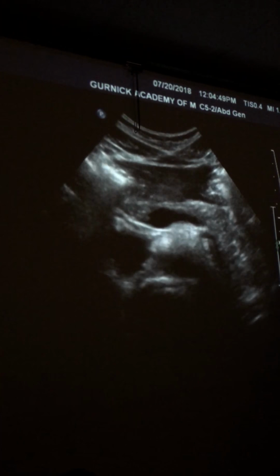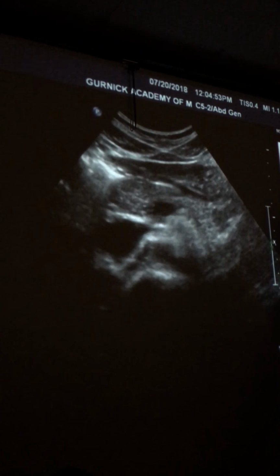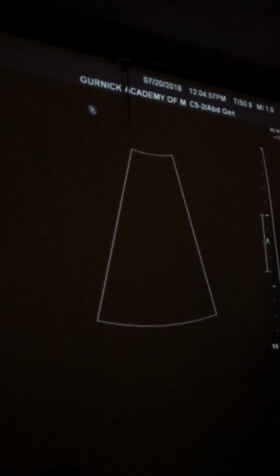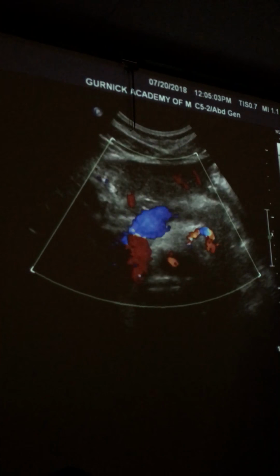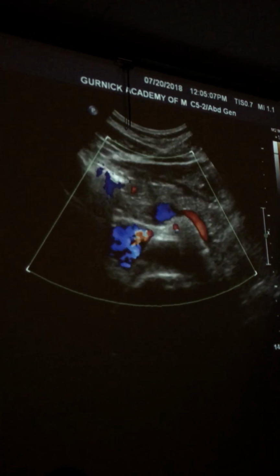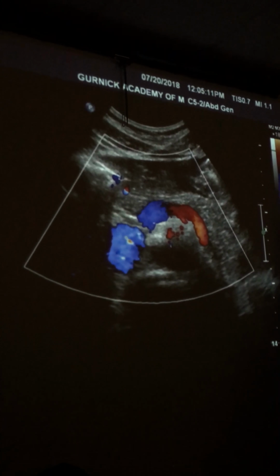So, is that good, guys? Call us over there, because somebody on Wednesday, I don't want to see names out loud because I don't remember who it was. I came over and you had no pictures of the pancreas. Like, well, I can't see the pancreas, and I went, that was me. It is, and it was perfect. That was me. Was that you? Yeah, it was me. You're like, I've never done the angling down, I can't see it now. I'm like, but I'll never miss it again. It was there before.